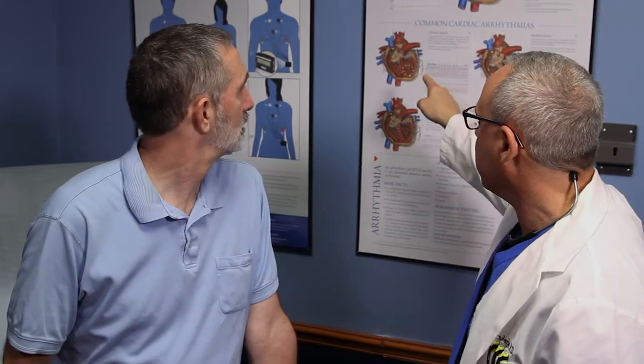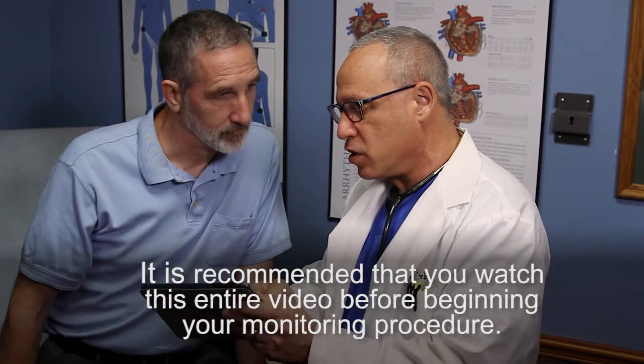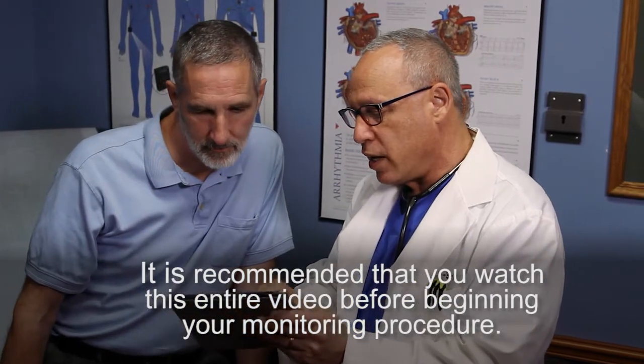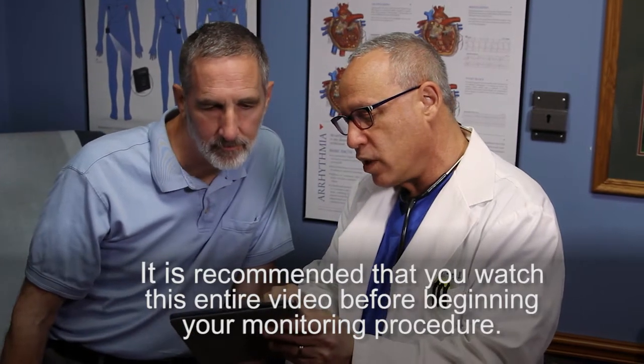Your doctor has prescribed the Duet cardiac monitor, an entrusted Medicom, to help identify possible cardiac arrhythmias. To provide your doctor with the most accurate information, it is recommended that you watch this entire video before beginning your monitoring procedure and fully review the documentation included in the kit.